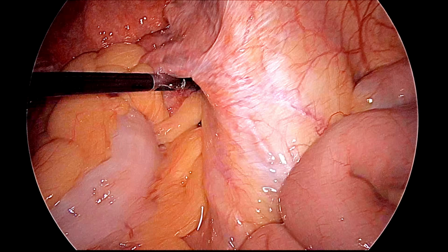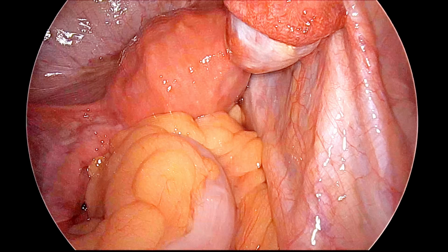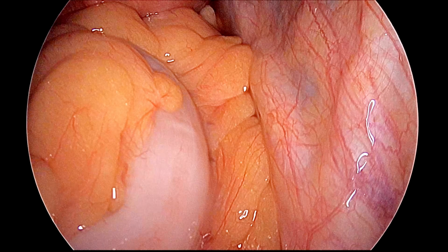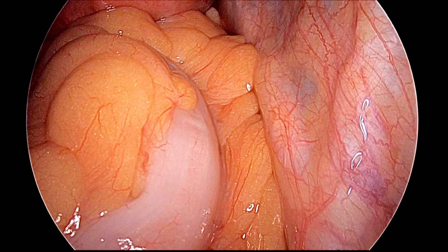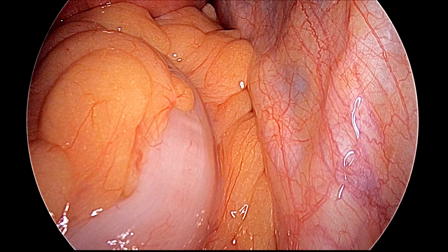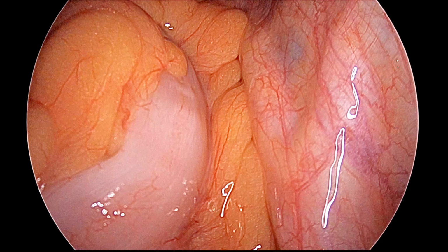So this is the internal iliac below, and here is the pulsation of the internal iliac. Here the bifurcation of the external and internal iliac is clearly visible, and below is the ureter. So this is the laterally going external iliac artery, below is the internal iliac, and medially there is the external iliac vein.